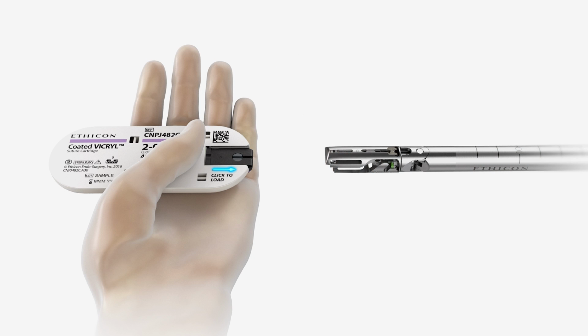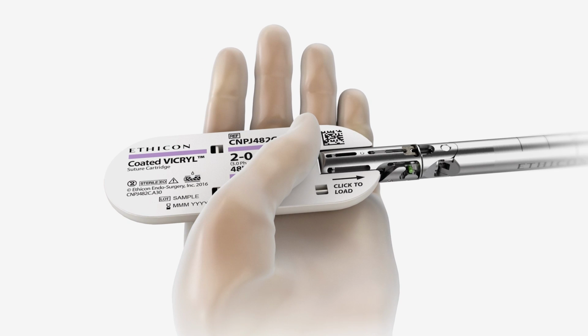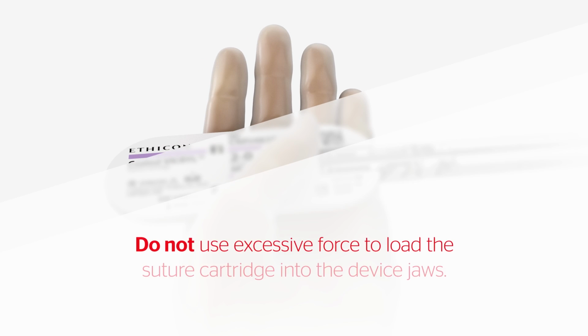Align the arrow on the suture cartridge tray lid with the instrument jaws. Insert the suture cartridge into the instrument until you hear a click and the suture cartridge is secured in the device jaws. Do not use excessive force to load the suture cartridge into the device jaws.